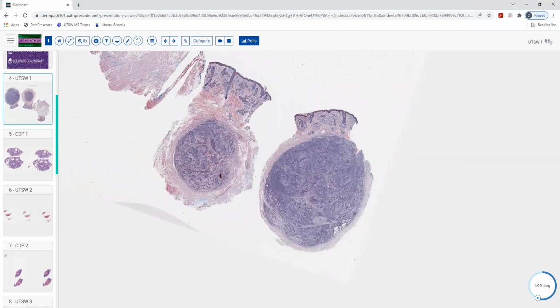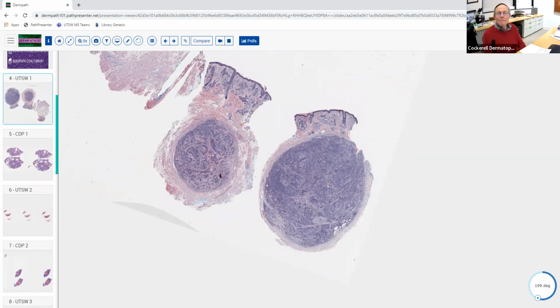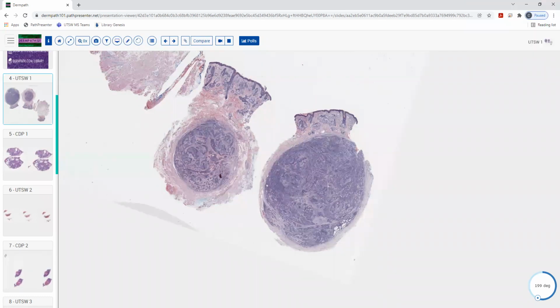I can start. This looks like a ball of a neoplasm that's proliferating in the dermis. And it almost has this architecture, I don't know what the right word is, but it's very blue. That's just what I noticed on high power. And it almost looks tubular or branching at this power too.